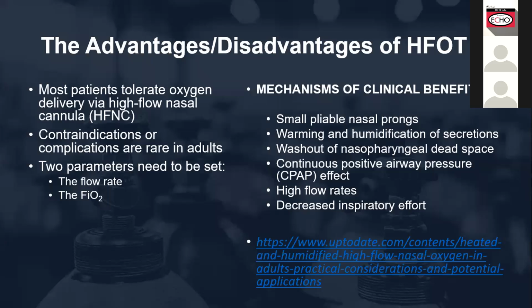And warming and humidification of secretions, then washout of nasopharyngeal dead space. Of course, it will provide a continuous positive airway pressure in your respiration, and then it will give a high flow rate. Of course, the big benefit is to decrease the inspiratory effort for your patient.